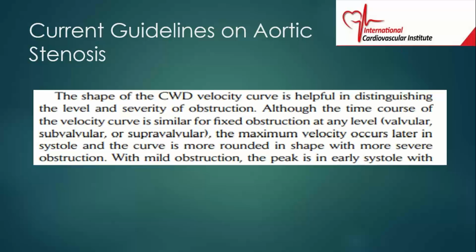Another very important point is the shape of the curve. Sometimes we look at the continuous wave Doppler velocity curve, and it helps us to talk about the severity of the stenosis and sometimes the level of the obstruction. So let me just draw a few things and highlight that for you.